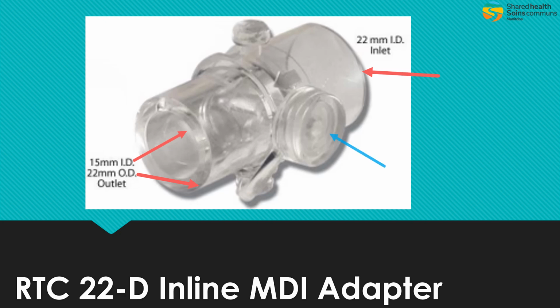The other part of this device that is very beneficial for us is this port adapter here called the canister activation port. This is where we're actually going to put our MDI canister into the device so we can administer salbutamol.